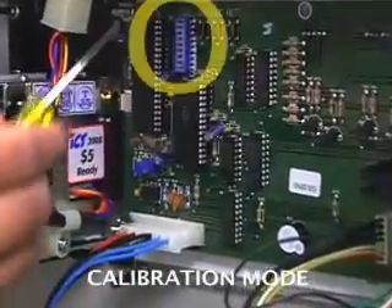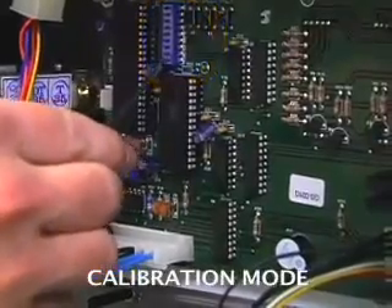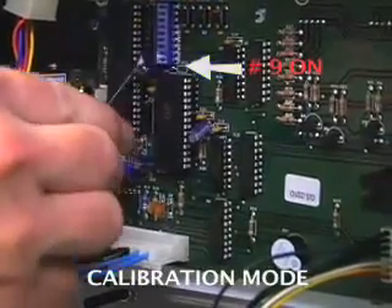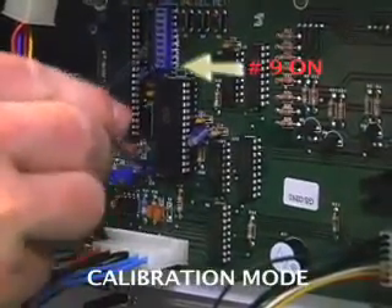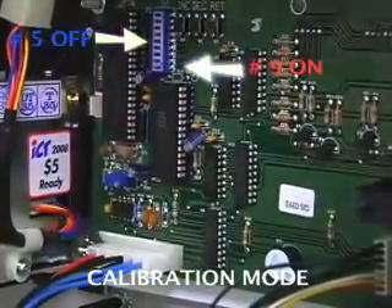On the main electronic board, there are nine blue dip switches located on the left side. We are going to switch nine on and switch five off. Now the machine is in calibration mode — that's nine on and five off.